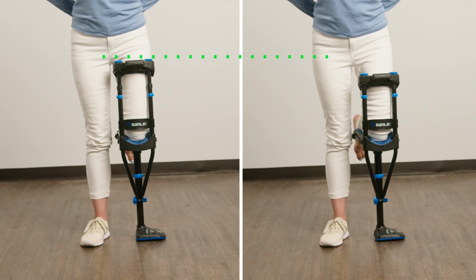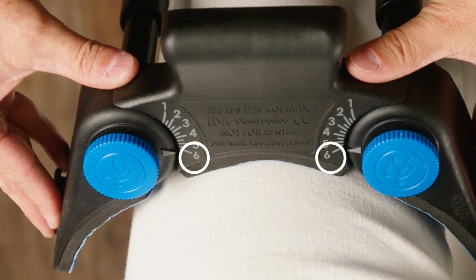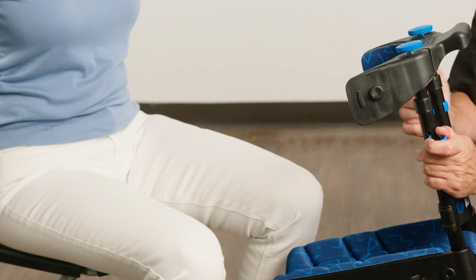Height adjustment, upper leg. The height adjustment for the upper leg allows you to position the handle and thigh supports at the top of the thigh. Position it as high as possible without causing discomfort. The higher it is, the more stable the crutch will be. To adjust, make sure that the 2 thigh supports are at setting number 6. Then remove the 2 blue C-clips.